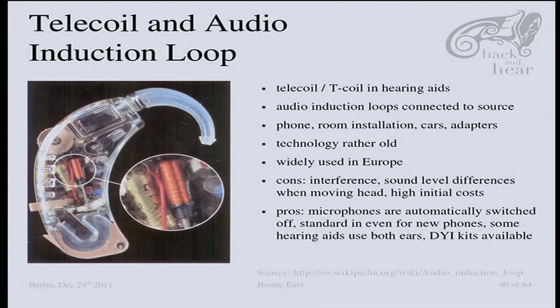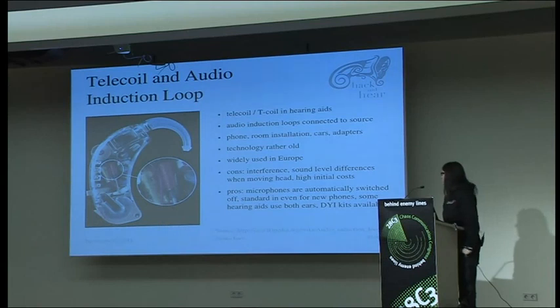There are adapters with an induction loop that you hang around your neck, or there are induction loops installed in lecture halls like this. I don't know if there's one here. It's widely used in Europe, especially in Scandinavia. They even have laws where every public building has to have one, or at least public lecture halls.